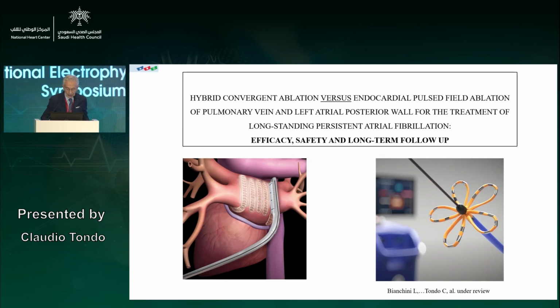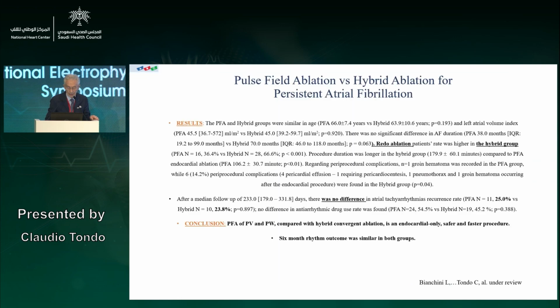This is a study that is under review right now, where we compare Farapulse for persistent AF or redo patients to patients undergoing hybrid ablation.